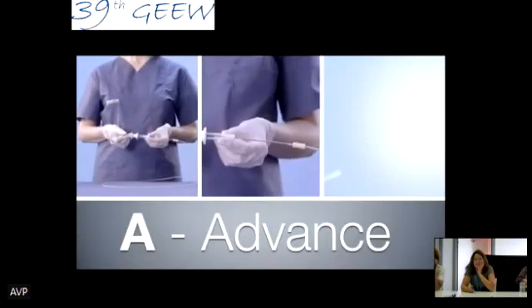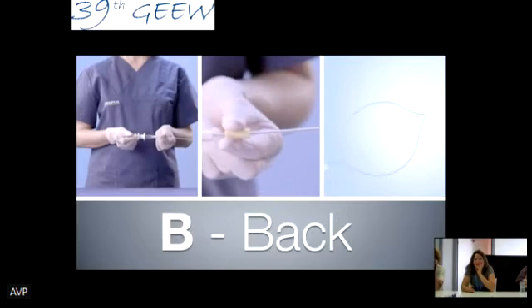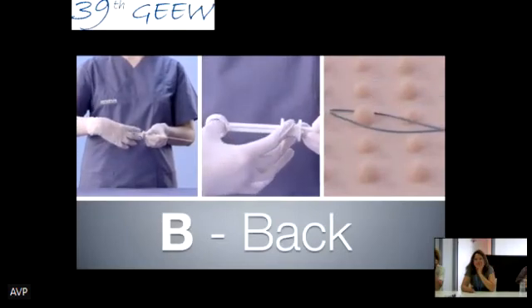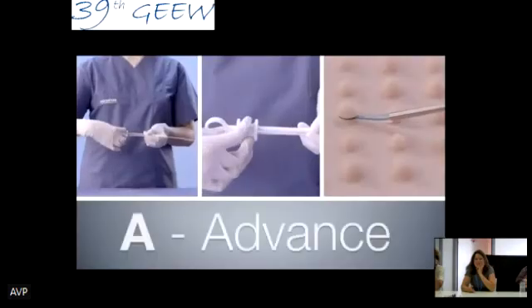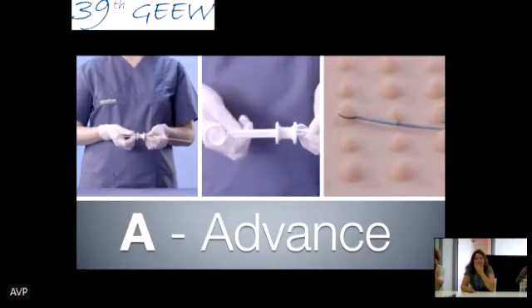So it's advance, bring back, that's to open, that's to ligate, bring back, and then advance to deploy, to release.